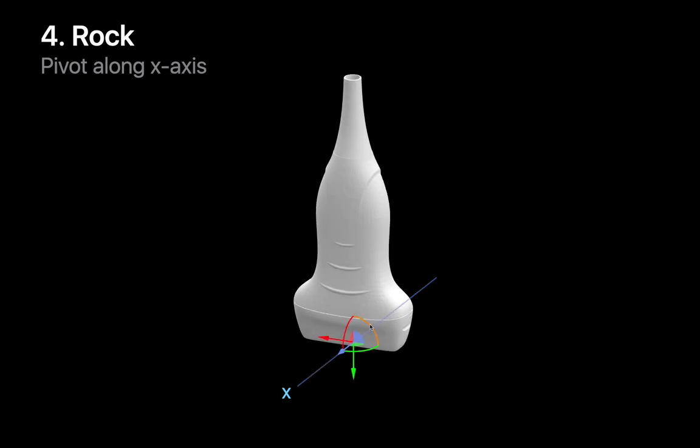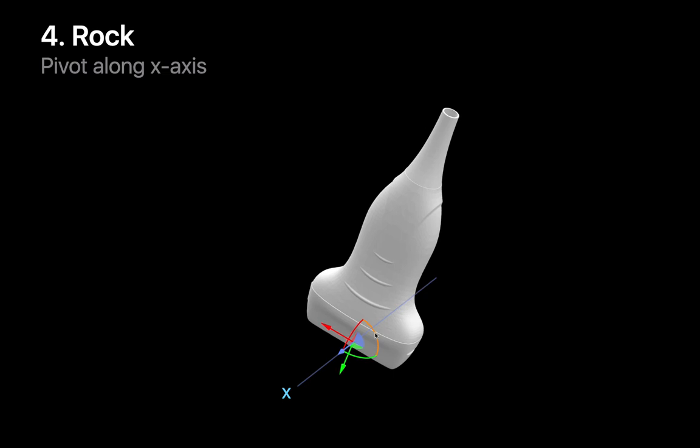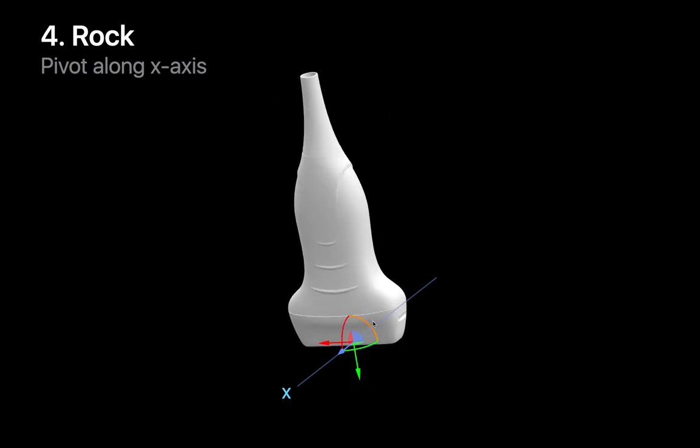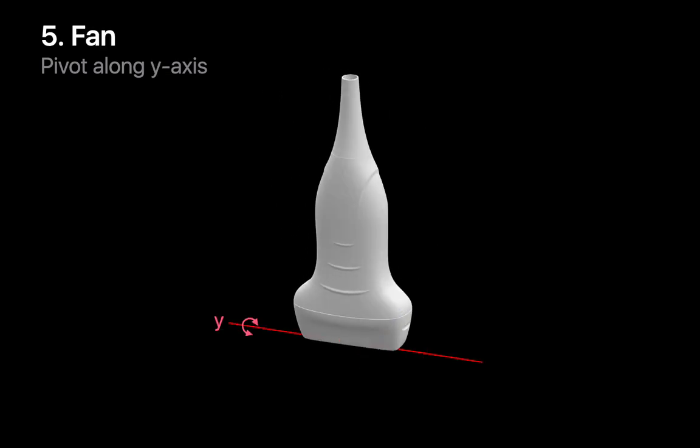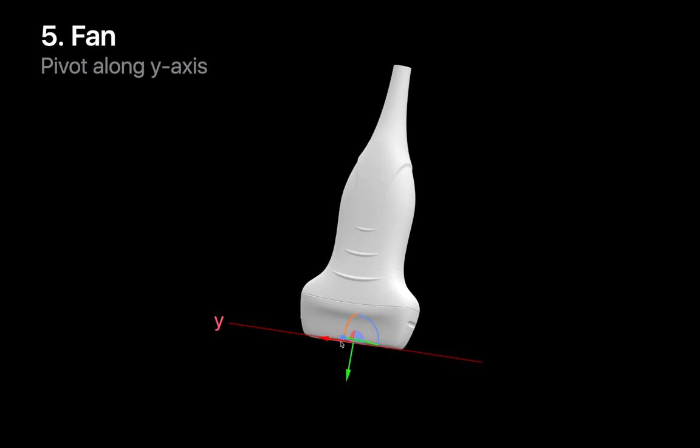Pivoting in the long axis of the probe about a fixed point is called rocking. Pivoting in the short axis of the probe about a fixed point is called fanning.